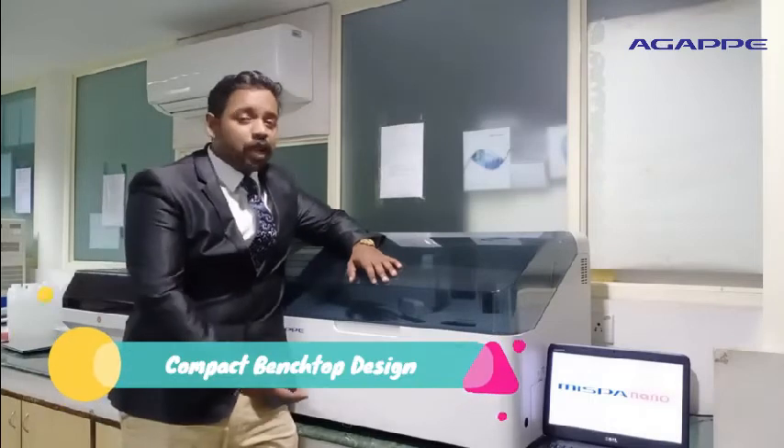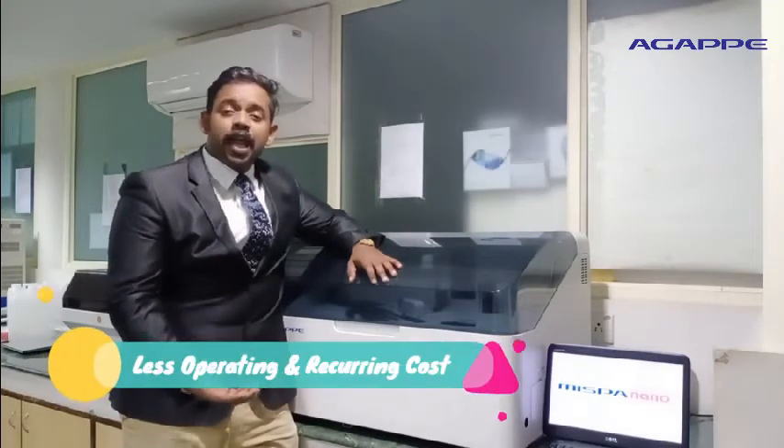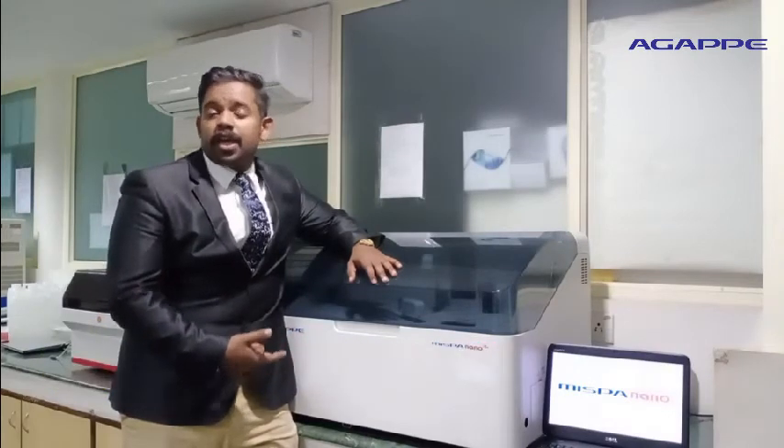Being a compact bench top design, MISPA NanoPlus can run with less operating and recurring cost. MISPA NanoPlus is the best bio-automation analyzer this year, incorporated with several best features.